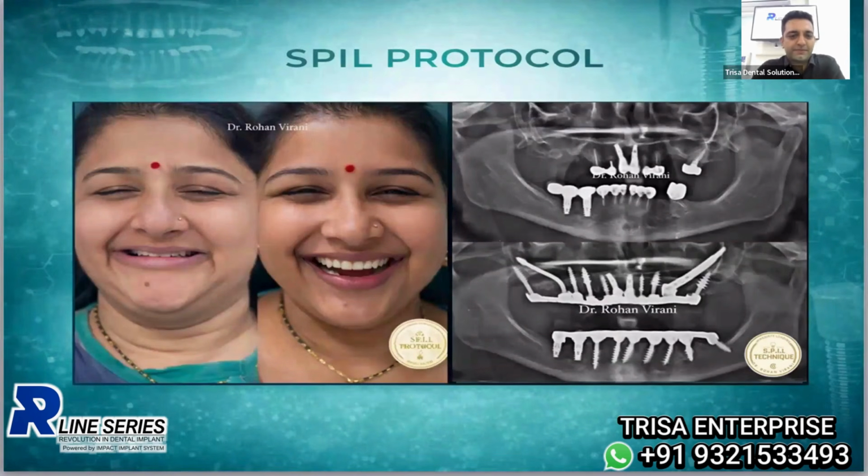Look at this case. This lady comes with two conventional implants in the anterior maxilla, failing dentition in the maxilla, rejected by one or two doctors saying there is lack of bone. One or two doctors told her that she has to go for delayed loading procedures, which she was not ready for, considering there is a function in her family. In the lower jaw, her anterior teeth constantly get dislodged because the teeth remaining are just root pieces. And now I plan to start the case.